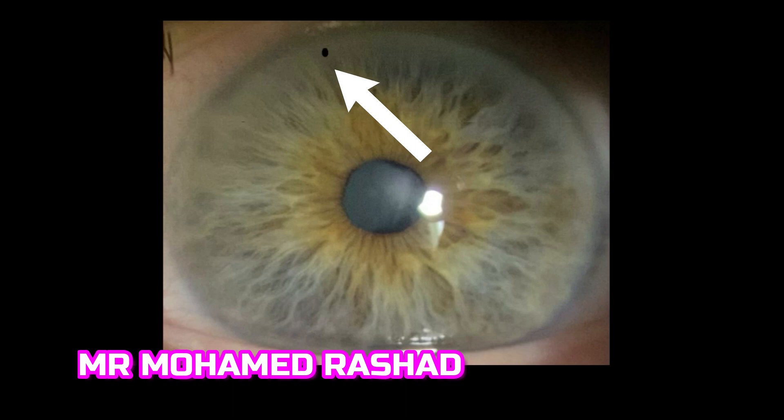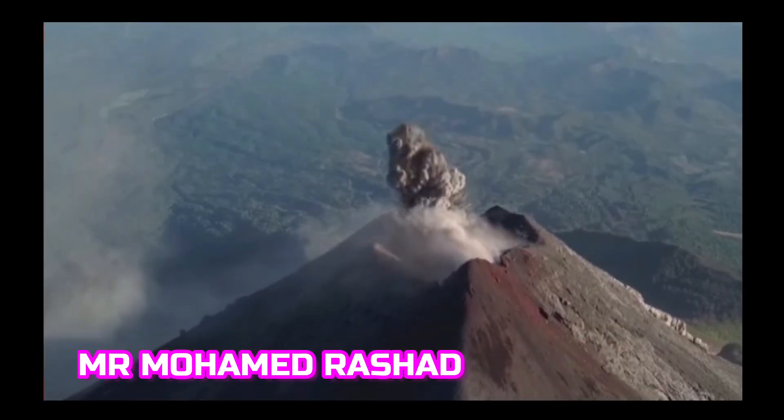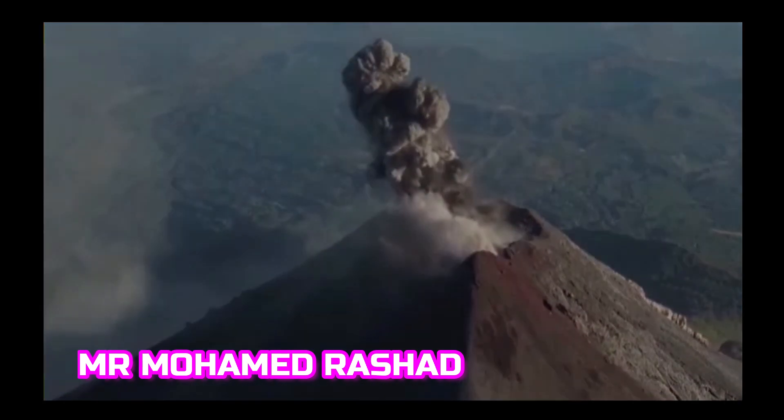I usually start at this black dot area in a crypt and enlarge it with high power, high magnification, and medium aiming beam. The most sure sign that you are full thickness through the iris is the gush of pigments and aqueous from the opening, which I call the Rashad volcanic eruption sign — the gush of pigments and aqueous is similar to a volcanic eruption.